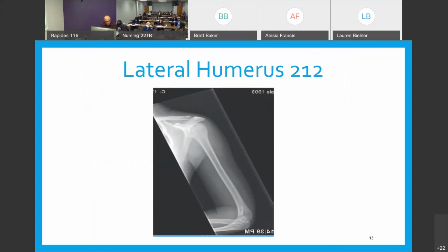Okay, we're on page 212 now, and it talks about the lateral projection. I want you to look at the very top of that page, 212. Look at the two positions or projections, I should call them: lateral medial, medial lateral.